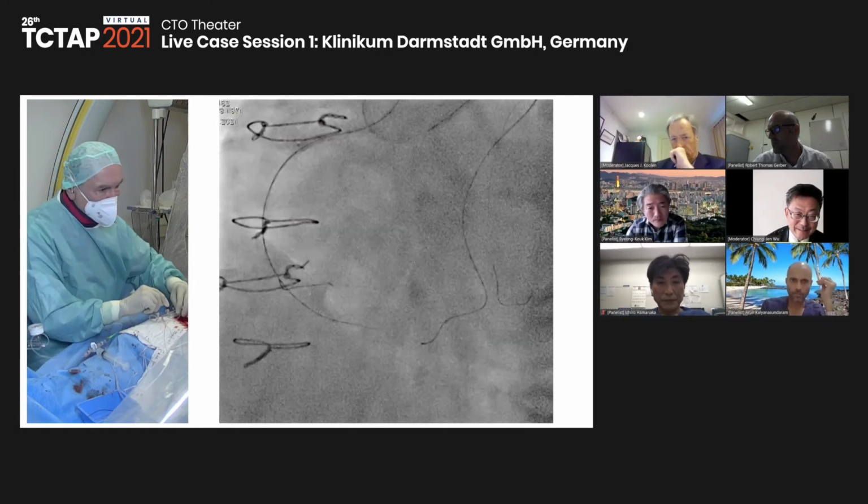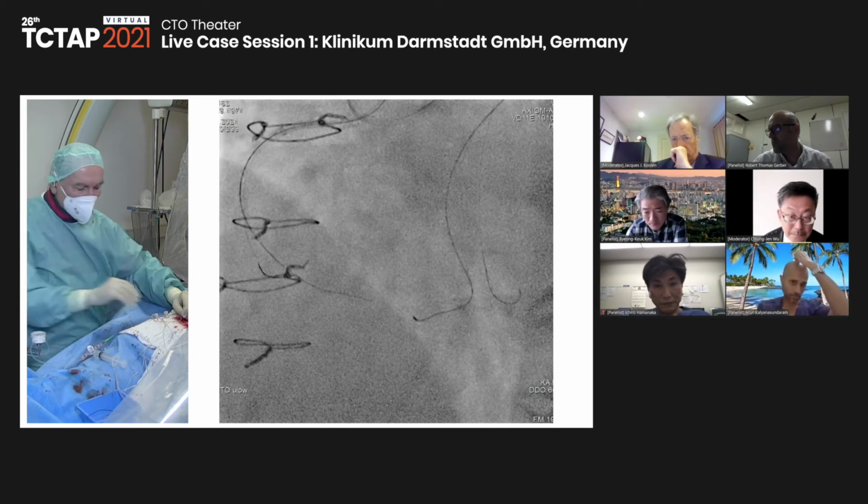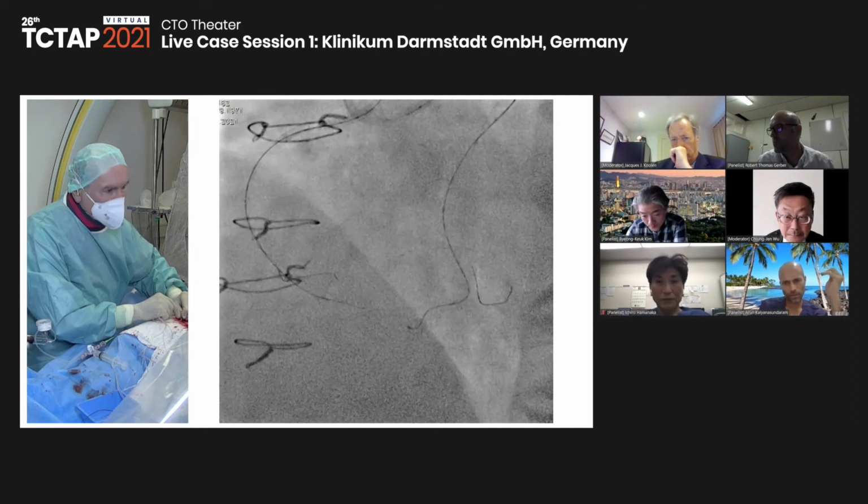Sometimes you see the retrograde wire. That's the problem when it's only a short advancement. It was already moving back down.